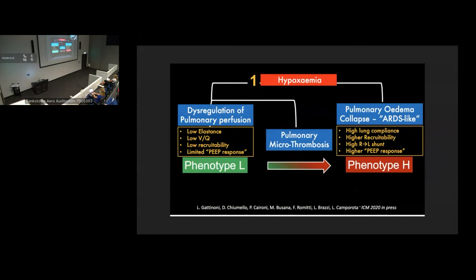That's about as much physiology as I'm going to talk about, and I'm going to get on to now talking about the use of ECMO in COVID. And we've got quite a bit of experience with it now, both internationally and nationally. So I really want to highlight first that this disease, despite the variant, is still displaying two different types of phenotypes, particularly in the ECMO population. And I want to touch briefly on these phenotypes as they're going to impact on the prognosis of ECMO patients.